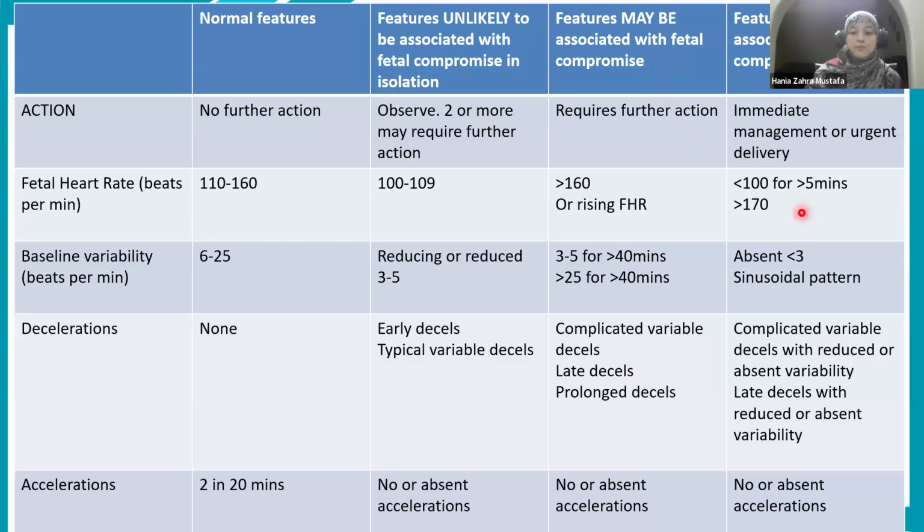If any one of these is present in the CTG, then it requires further action. And if any one of these is present in the CTG, then it definitely tells us that the fetus is compromised, and we need to have urgent management and urgent delivery of the baby.